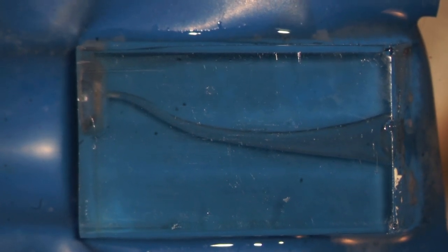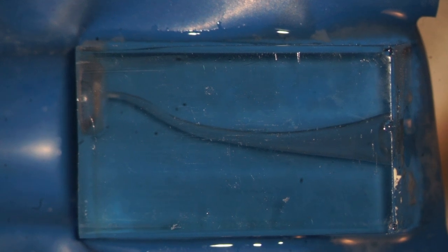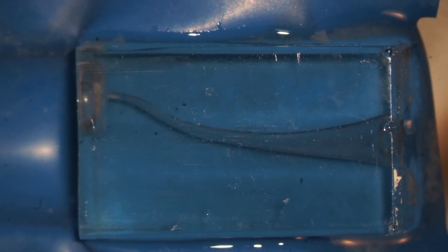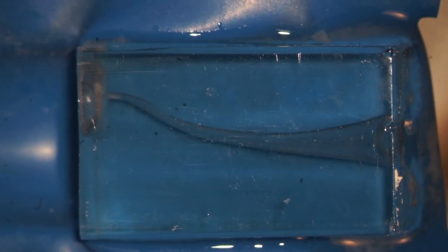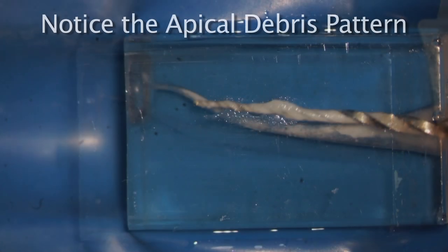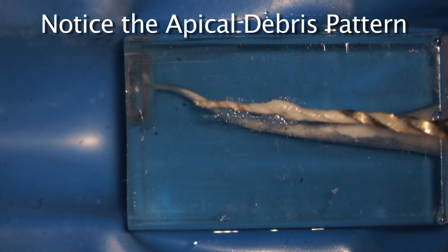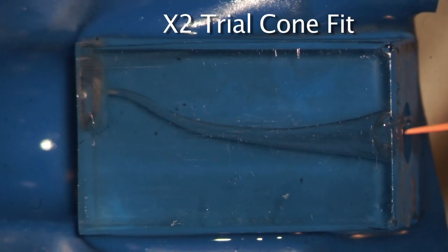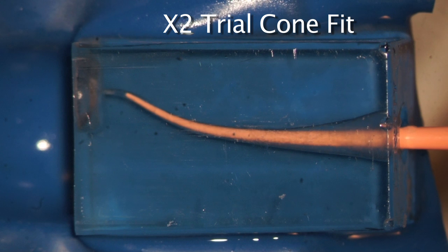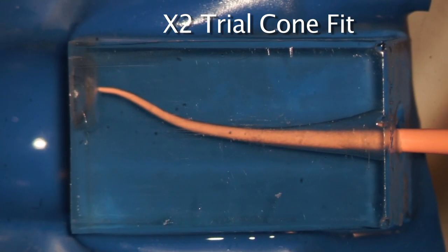So at this point, we could ask ourselves if we're done. And what we might want to do is use a gauging file. But a lot of us just look at the terminal part of our file. And if our file is loaded with debris, you can be very confident that that instrument just cut its shape in the apical one-third. So that means the 2506 came out loaded. We could probably fit a cone at this point. We'll do it just for fun. So here we would be using a matching ProTaper Next gutta-percha point. We would always fit a cone in a wet canal of our ProTaper Next X2, and we can slide it right to the foramen. And there it is.